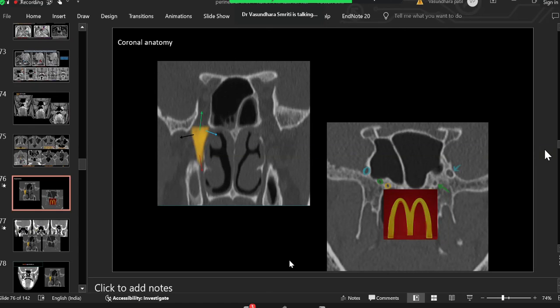If I'm looking at my buccal and I know my buccal is sitting on my mental foramen, I will trace my inferior alveolar. If I'm looking for a lacrimal gland, I will look at my superior orbital fissure. If I'm looking at my maxillary sinus lesion, I will look at my foramen rotundum. That is a habit which has formed after reporting the head and neck malignancies.